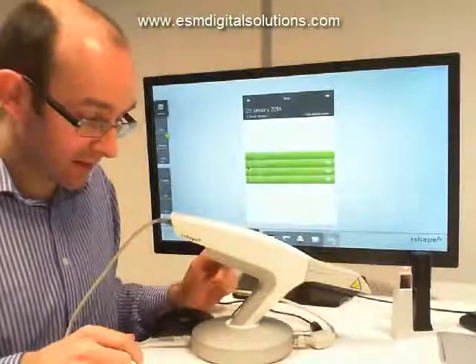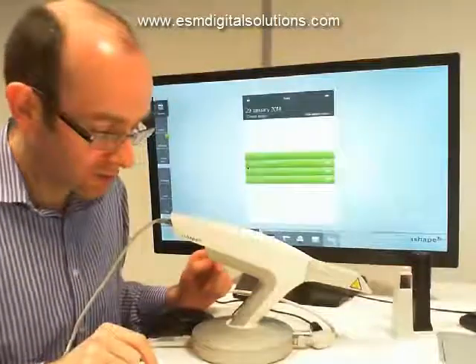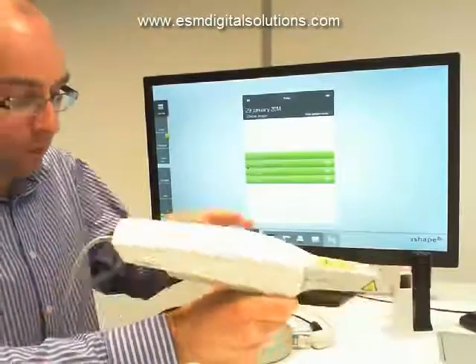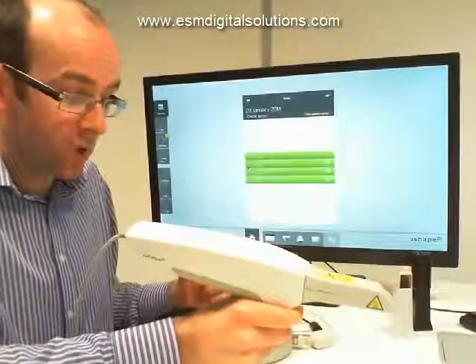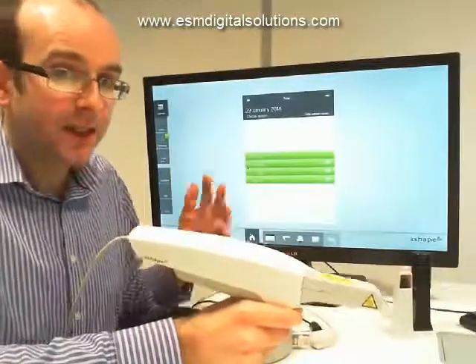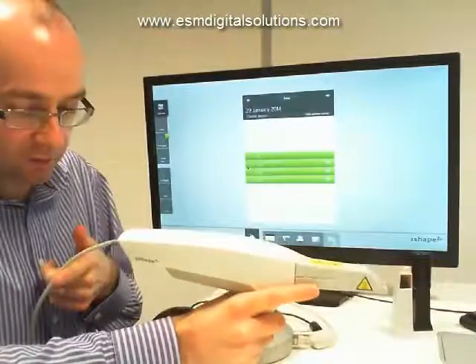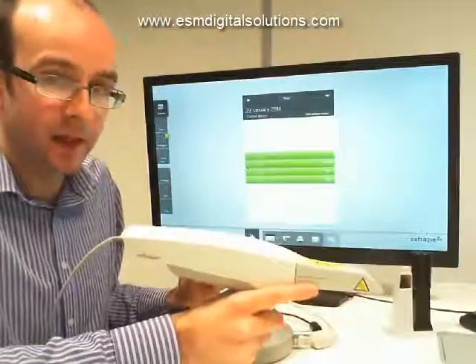It's not possible to transfer that data at an acceptable rate across a wireless connection, so it's important that it's fed through a wire. Another consideration is that with a cable we've got a leash — if there was no physical connection the scanner could easily go walking, and nobody wants that. Also, with wireless or Bluetooth connections, how many times has a connection dropped even for a split second? We don't want that happening in the middle of a scan or risk losing any information. With a strong, reliable, fast wired connection we're guaranteed the highest level of performance.